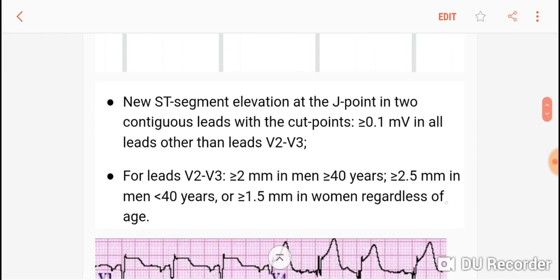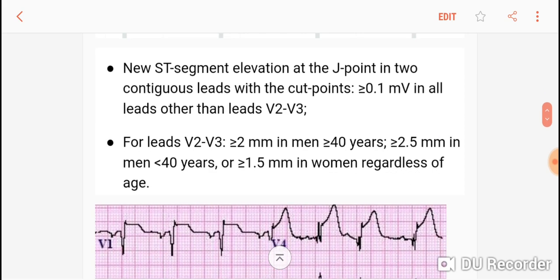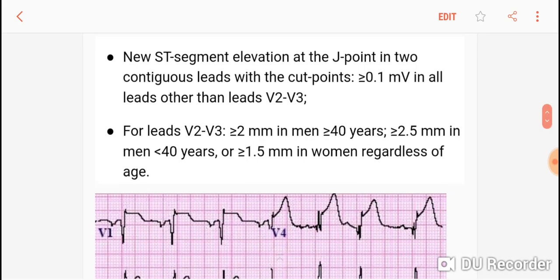What about V2 and V3? They are high-amplitude leads. So for V2 and V3, the threshold is more than 2 mm in men who are more than 40 years old, 2.5 mm in men who are less than 40 years old, or more than 1.5 mm in women regardless of age.